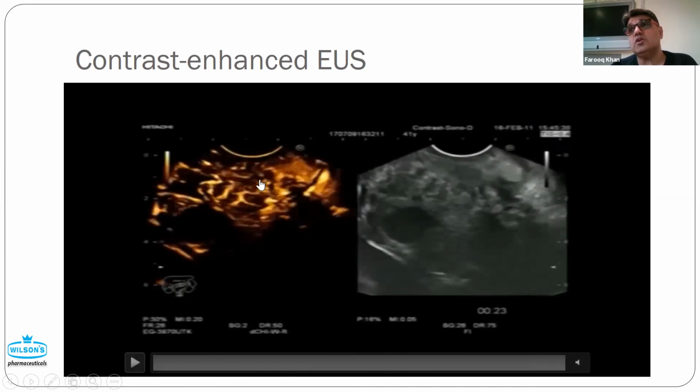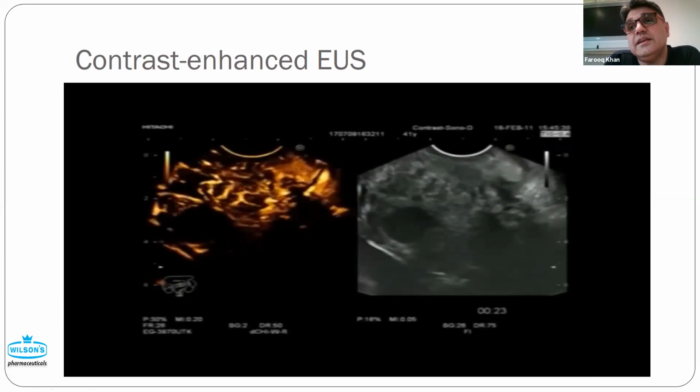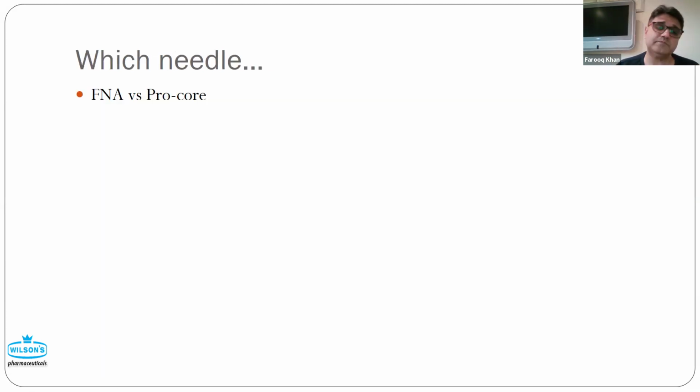So yes, contrast does help, particularly in places like where I work. We have a 28-bedded HPB ward unit, and at least 10 to 15 patients have chronic pancreatitic large masses. And it really helps us to focus or target our lesion better.